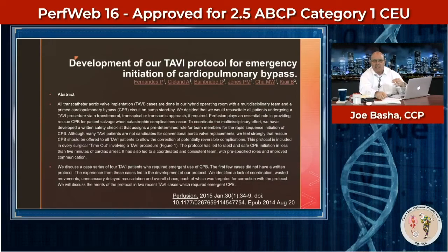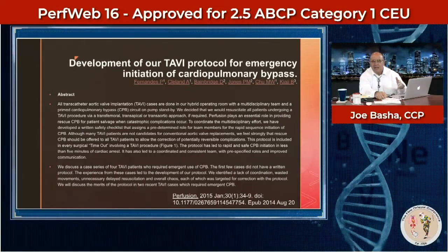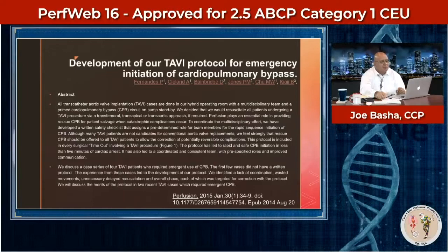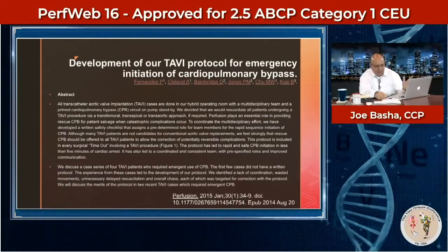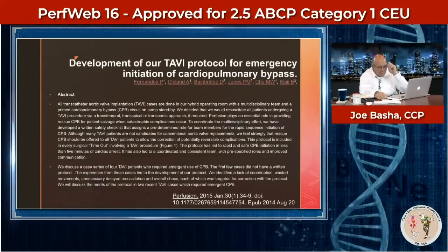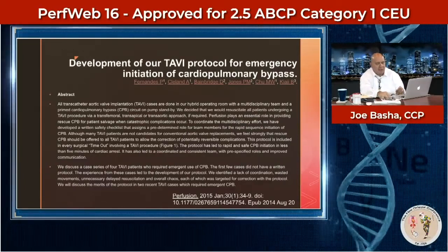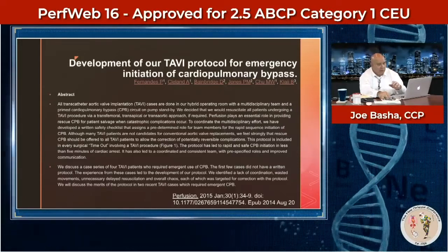The reason that they call it TAVR here in the United States and TAVI in Europe is because here in the United States, you cannot be reimbursed or paid by CMS for an implant, but you can for a replacement. So for us, it's transaortic, transfemoral or whatever, aortic valve replacement versus aortic valve implant. That's why that is. But all transcatheter aortic valve implantation or replacement cases are done in our hybrid operating room with a multidisciplinary approach and a primed cardiopulmonary bypass circuit on pump standby. Now, one would think that that's always the case.